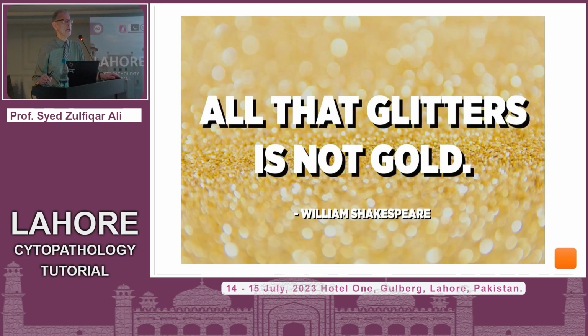So William Shakespeare said something beautiful. It can be Hashimoto. There were no lymphocytes. But written here is, all that glitters is not gold. The intranuclear inclusion was glittering. Remember the Frankie Valli song's lyrics? What did he say? You are too good to be true, can't take my eyes off you. So your eyes were just glued to the intranuclear inclusions.